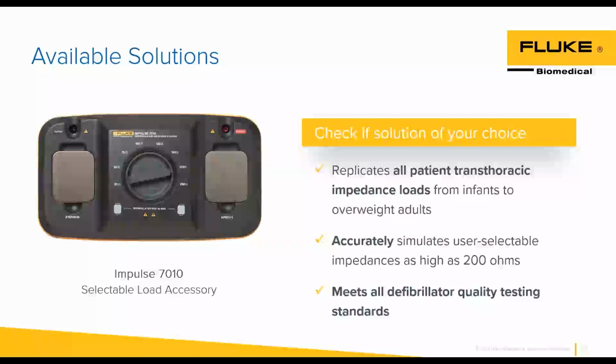If you've not used one of these defibrillator load boxes before, get a hold of your Fluke rep or go into Advantage Training. There are some things you have to consider. You have to set up your defib analyzer so that it can accept these loads. So things to keep in mind there. If you're going to use one and you haven't used it before, pull up the manual, go to Advantage Training or call your rep and make sure that you have it set up correctly so that you're getting the correct readings.